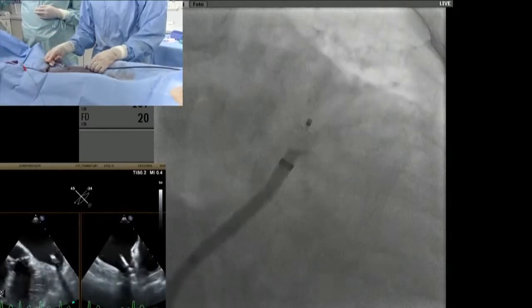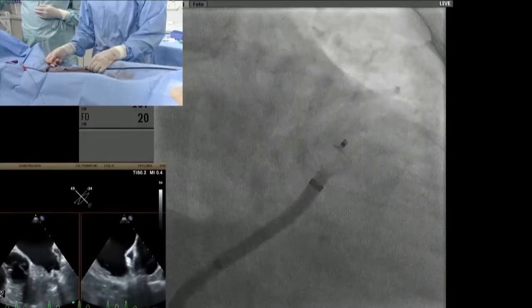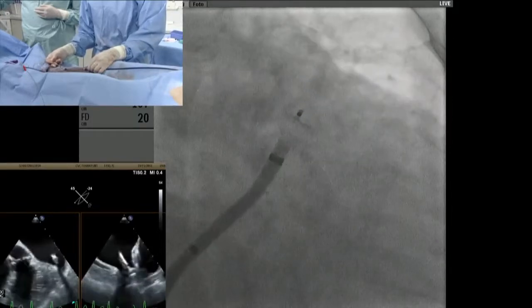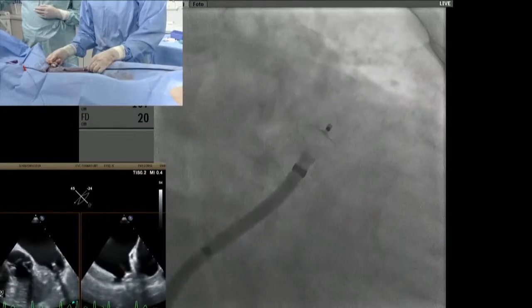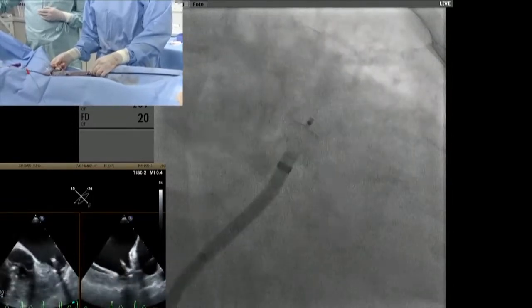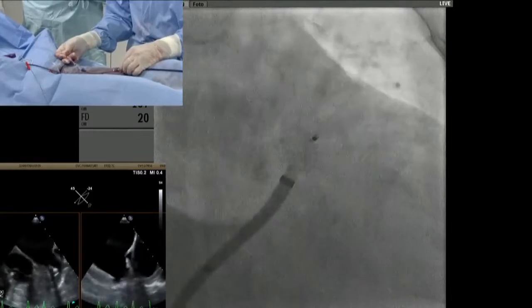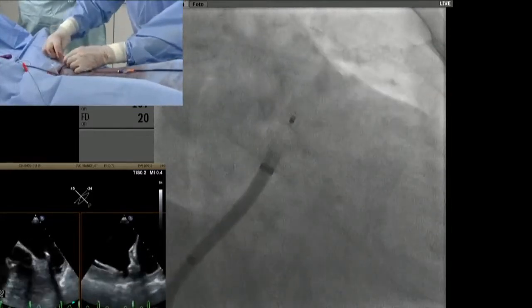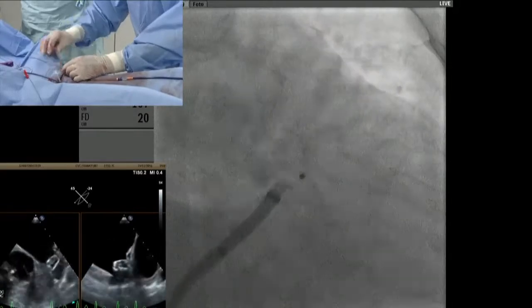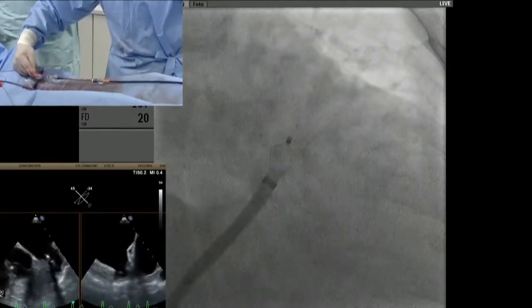Okay. This is very strong anterior. I think you should straighten the device in the sheath by violating the IFU and pulling into the sheath and moving a little bit so that you have a straight angle. I like that. Violate the IFU. Oh, it's far out, huh? It's okay. So let's try once more, then we retry the 25.